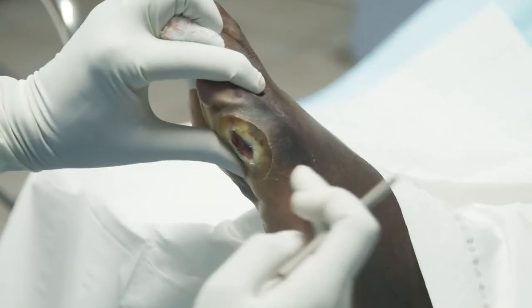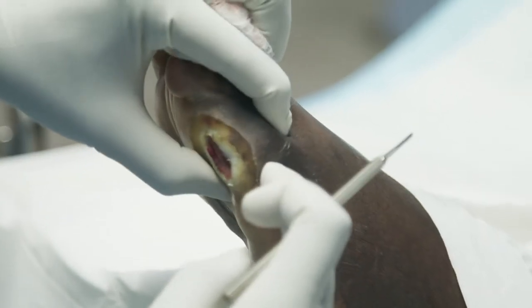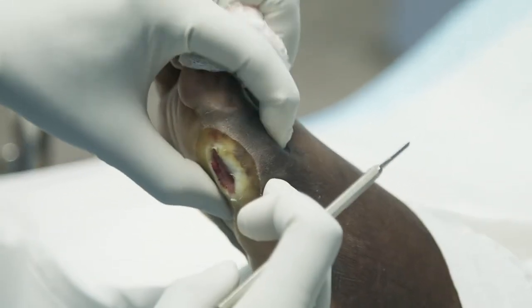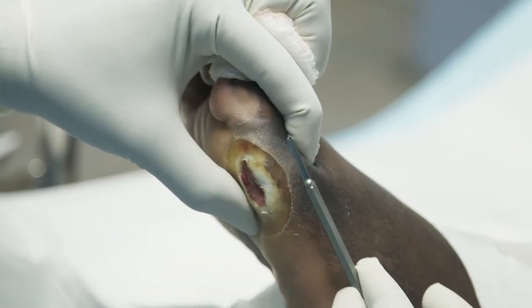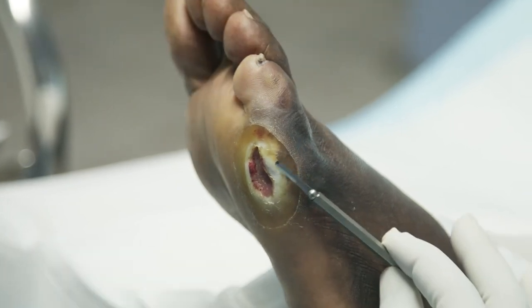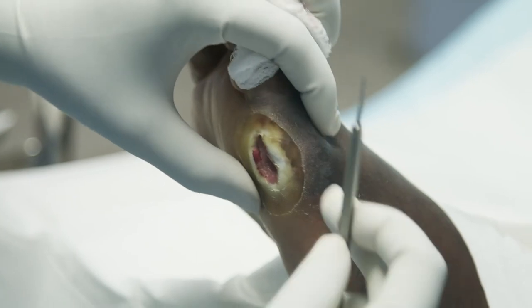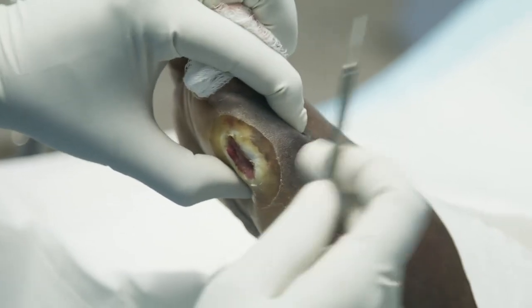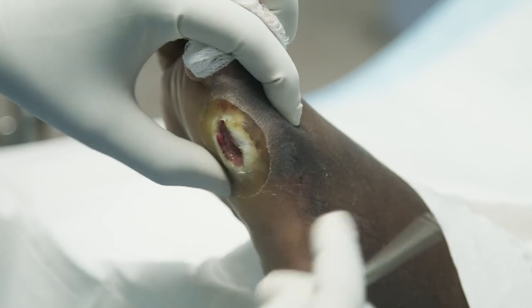Okay, so we saw where our pinhole was, where we did the thing on the x-ray. So we know for sure we're right there. We know that's the bone, we know that's the ulcer. So the pressure, this bone should be sitting straight and right. Instead, you can see it goes like this and like that. So we're taking the pressure away from this wound now. That's the bone right there and right here. It's coming right through the joint.